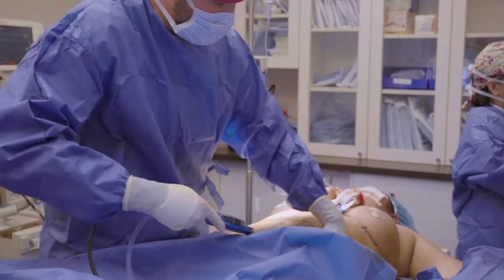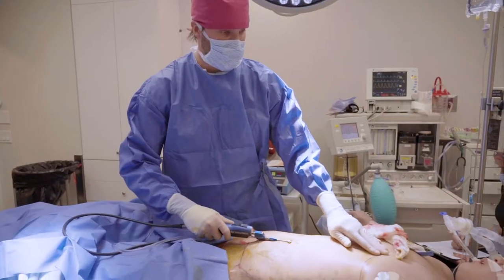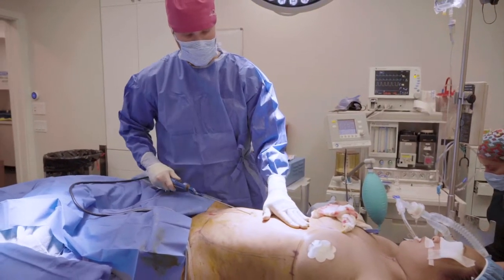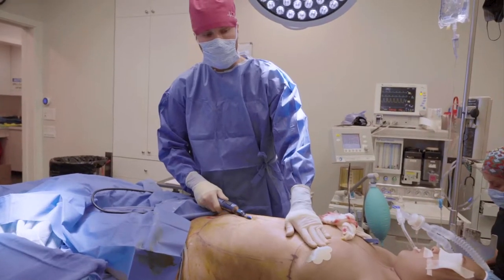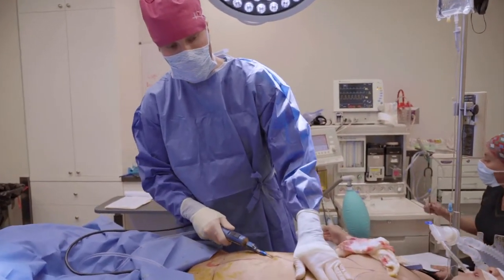But for her right now, it's going pretty well. I can see that there's fat that still could be removed, so I'm going to take that fat. I'm numbing the breast at the same time because after that we're going to do breast implants — might as well do it right now so it's ready, and the bleeding is stopped by the time we get to the breast.